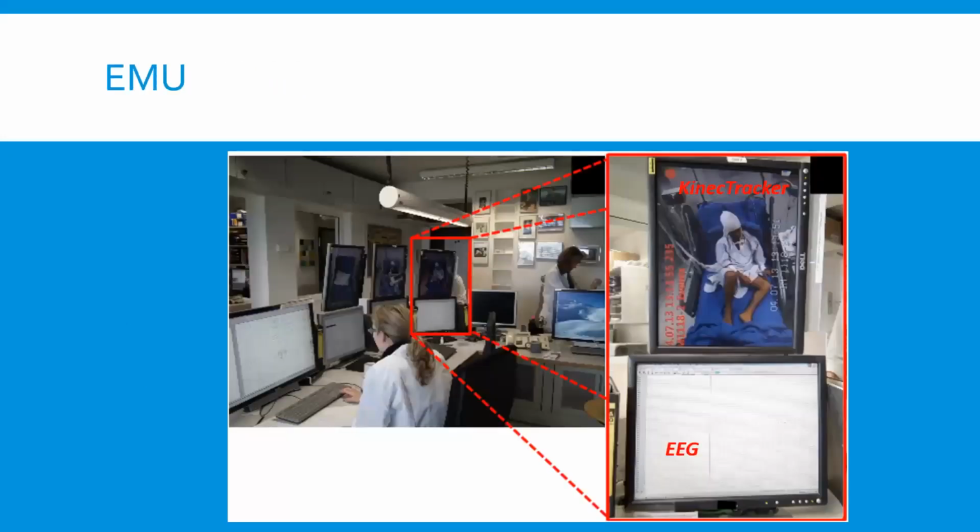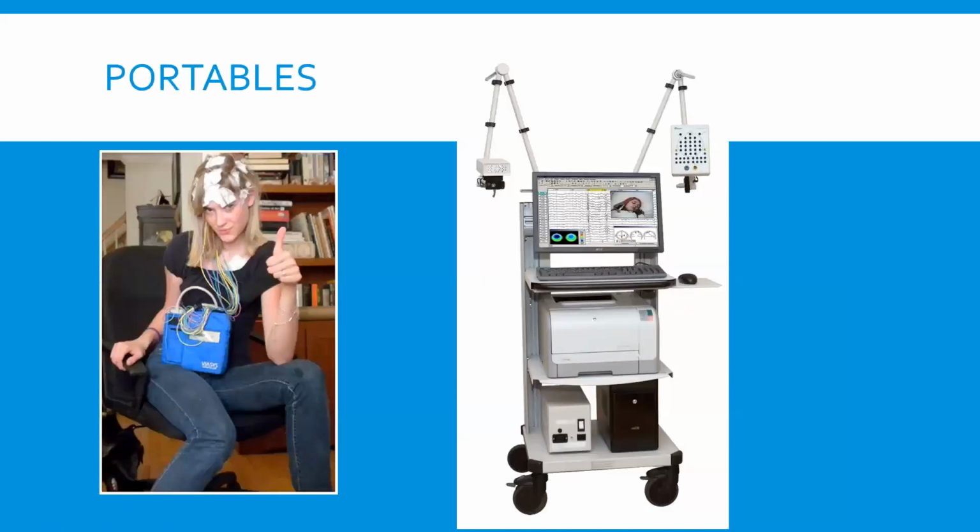So this is basically a picture of what we see when we're doing EEG monitoring. We can see these multiple computer screens where we can see the patient in the bed. This picture is from the EMU. This bed is specially designed for epilepsy patients when we're trying to capture a seizure. You can see the bed's very padded, there's a connection to the wall, and underneath there we have the EEG for monitoring. At big EMU centers, we can have multiple screens, so sometimes a technician is monitoring up to like 20 patients at once, trying to capture when they're having a seizure.